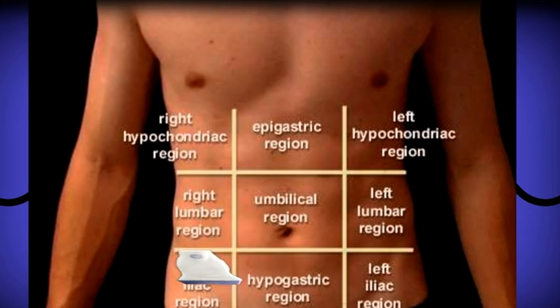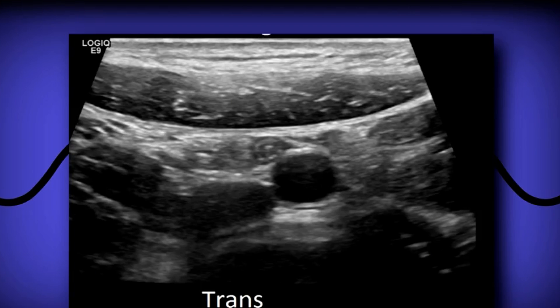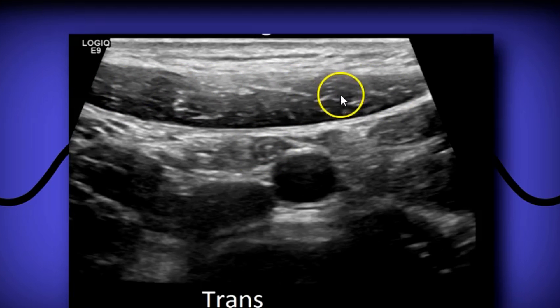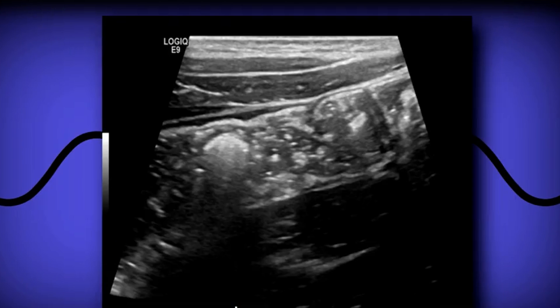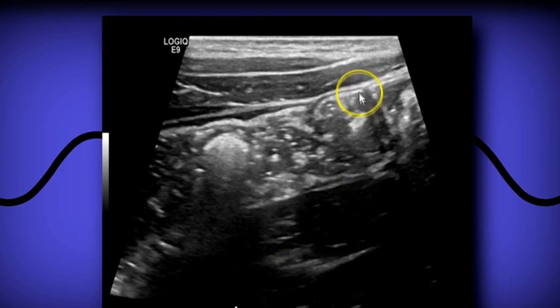Sometimes you might see an intussusception down there. Here in transverse you can see the iliac artery. Luckily in this patient the appendix was very easily visualized — it's normal. You can see the anterior abdominal wall muscle, rectus abdominis, and psoas muscle. Turning sagittal, you have the ascending colon with psoas muscle posterior to it and rectus abdominis anteriorly.